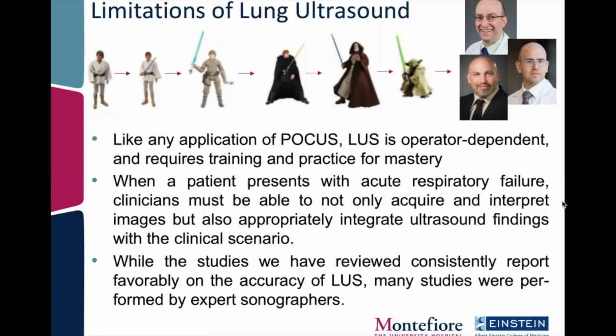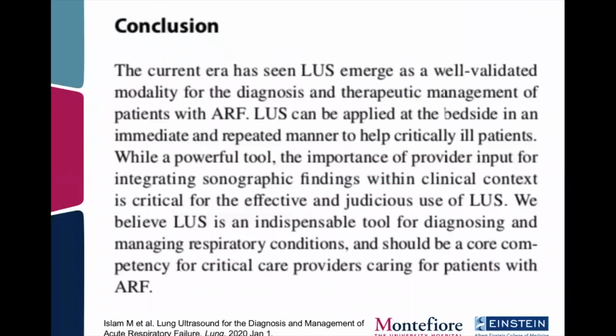So there are a lot of limitations in the studies that we reviewed, but overall, I think there is a pretty strong signal for lung ultrasound to be very applicable in acute respiratory failure.